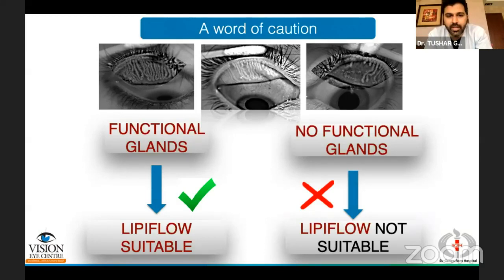Somebody who has functional glands is a lot more likely to be able to respond well to treatment. Whereas on the other hand, somebody who has a significant amount of gland dropouts is likely to not respond very well to any treatment, including the LipiFlow. So offering an expensive treatment modality to somebody with significant gland dropouts is probably not the best idea. And this imaging modality helps us identify that.